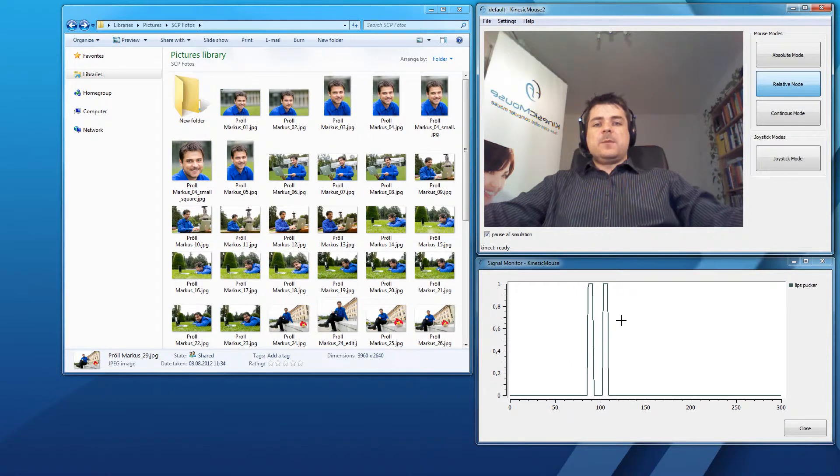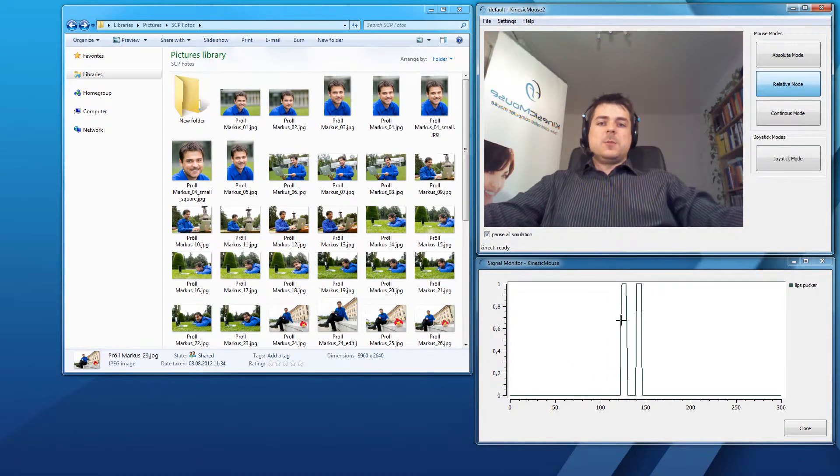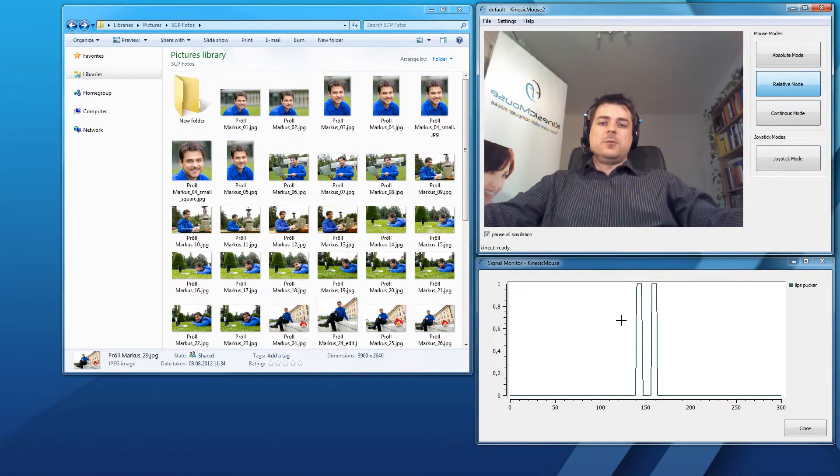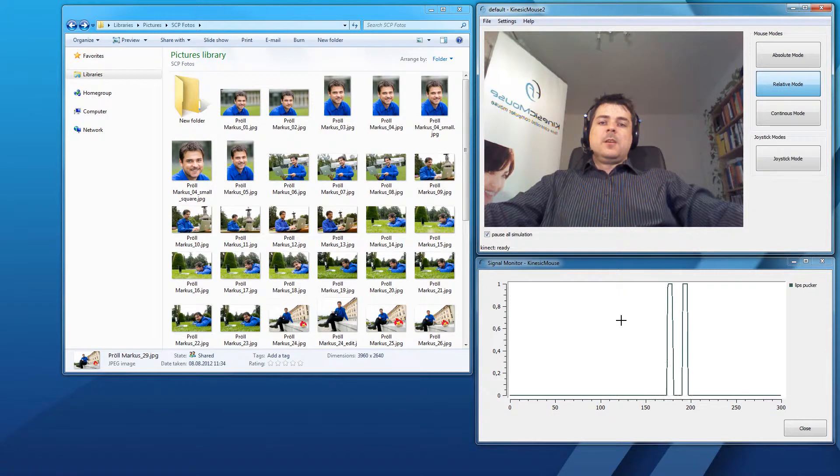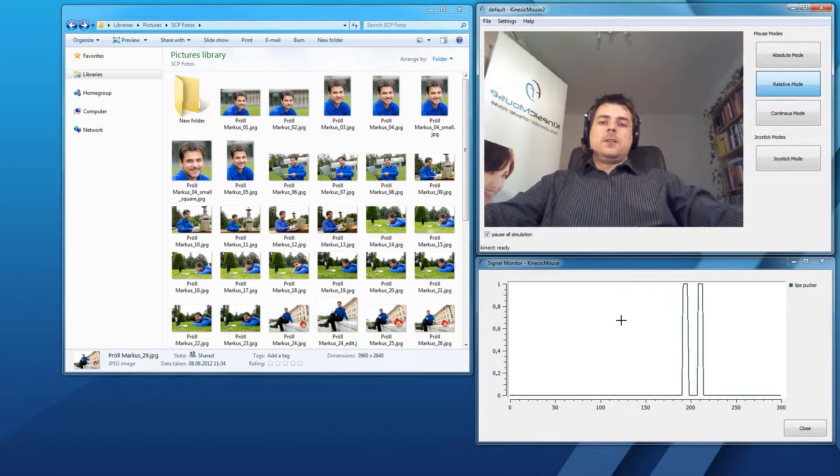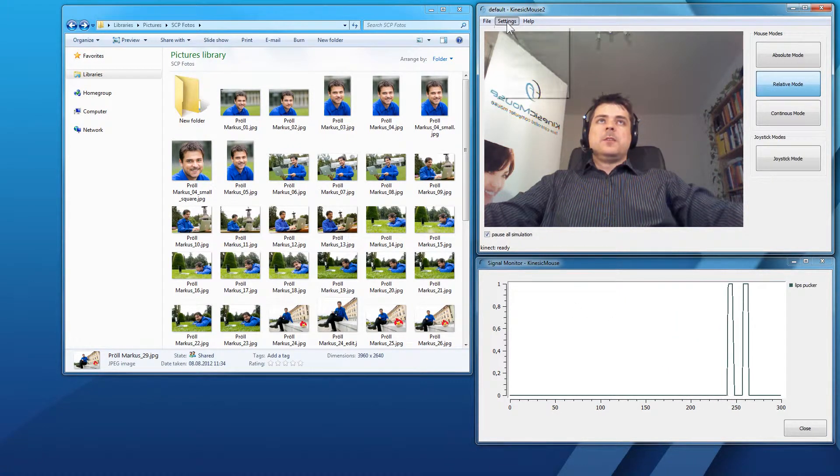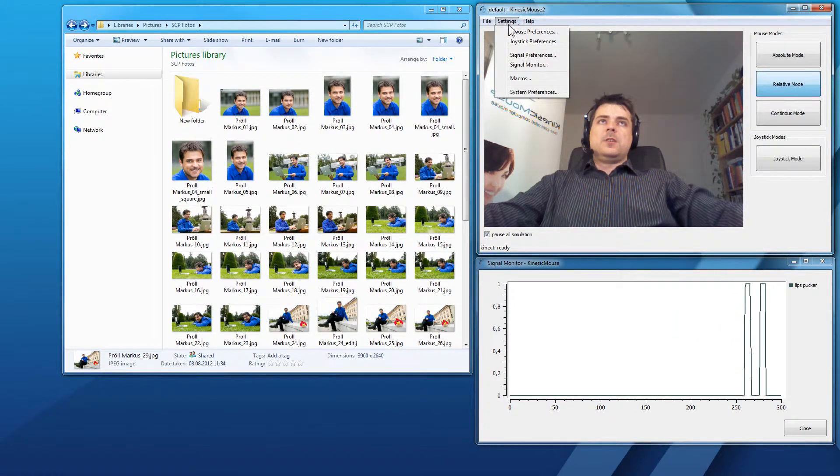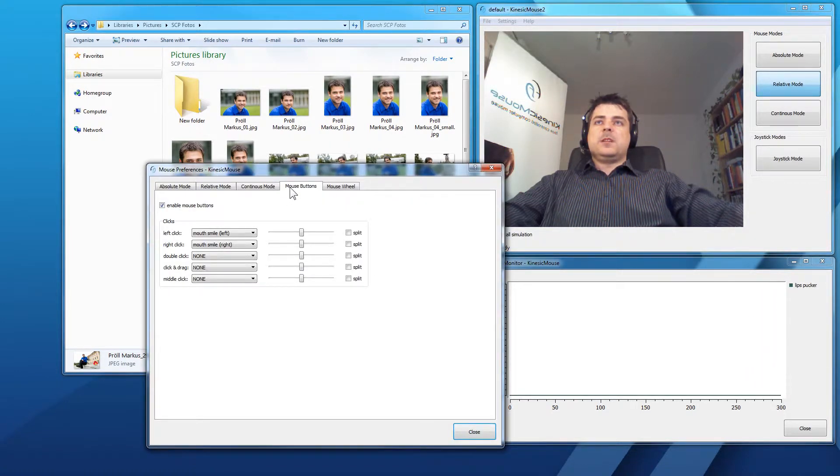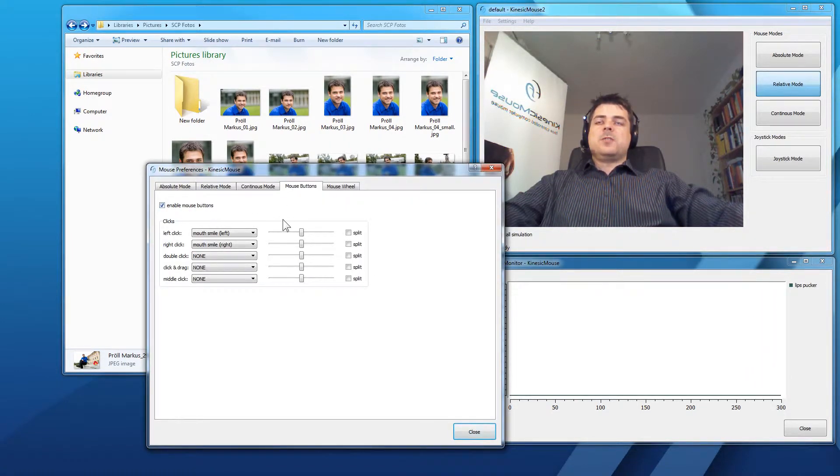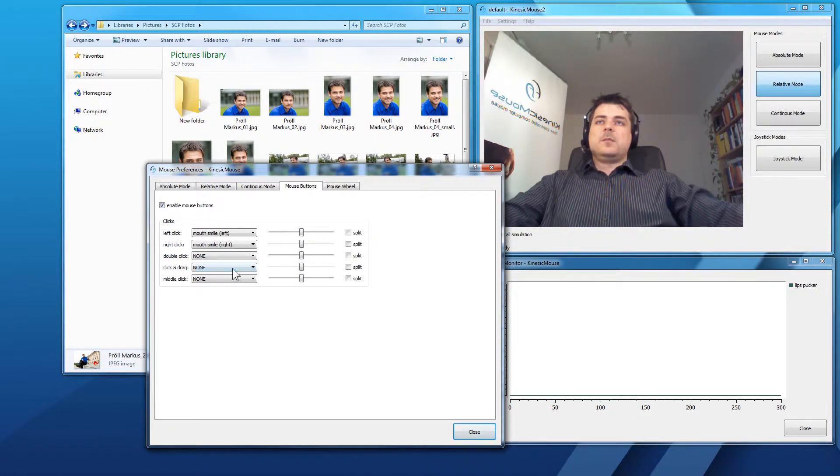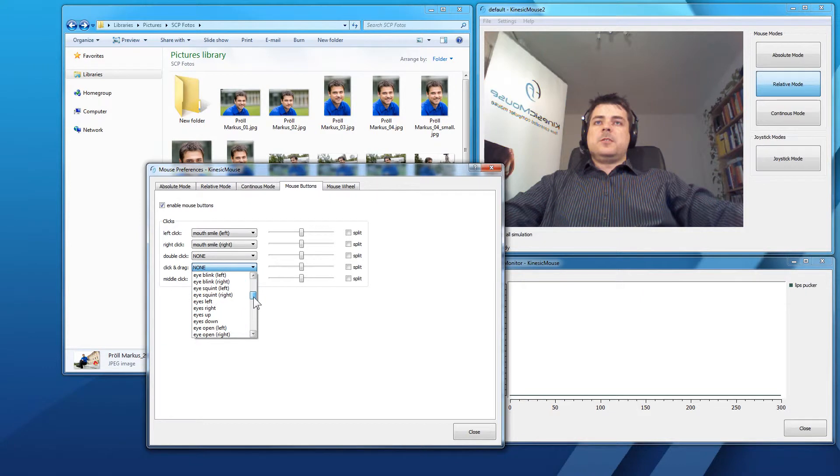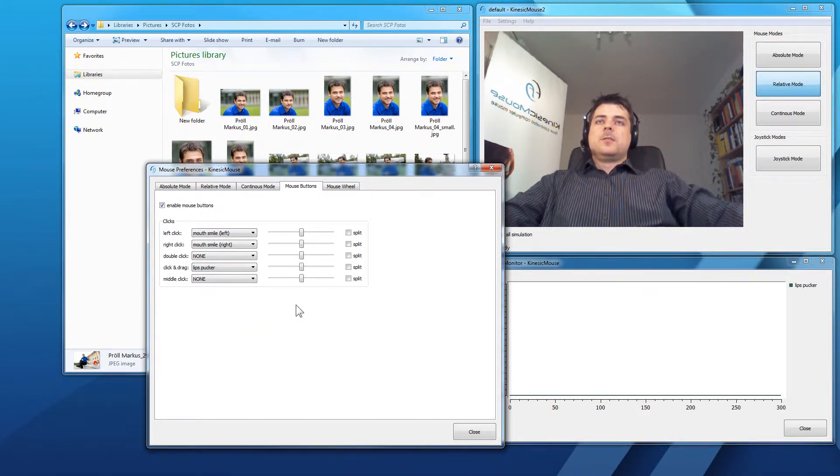Actually, in the KinesicMouse we have three options to perform a click and drag. Let's start with the first one. Let's go to settings, mouse preferences, mouse buttons. Make sure that you have checked to enable the mouse buttons and here we have our click and drag. Let's choose the lips pucker signal and that's it.